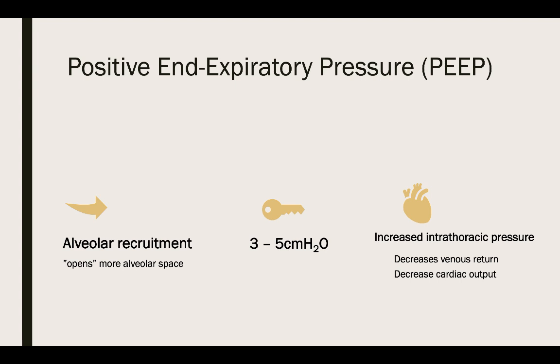So we're going to set it. If your patient doesn't really need any PEEP, there's no underlying respiratory issue with your vent patient, we probably don't need any.